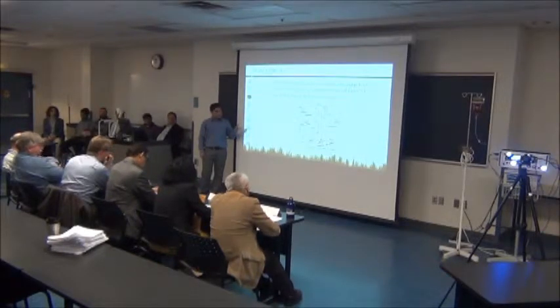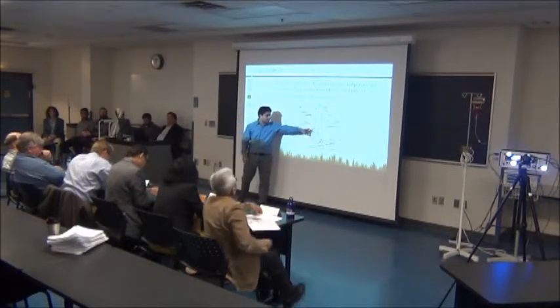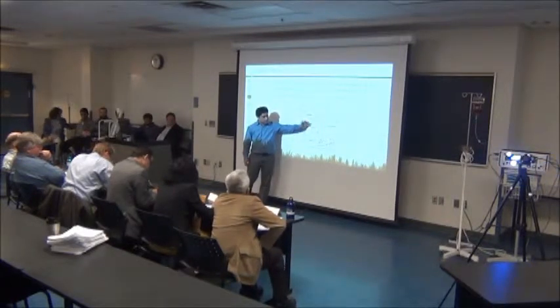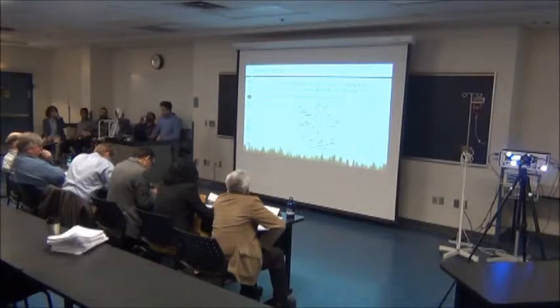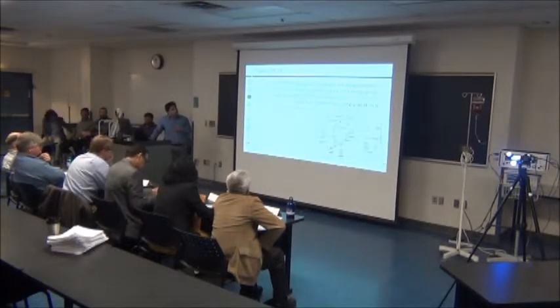It is made to null the acquired signal. At pin 5, we can control the zero line from +5 to -5, so depending upon the requirement of the pressure signal, we can control the offset.